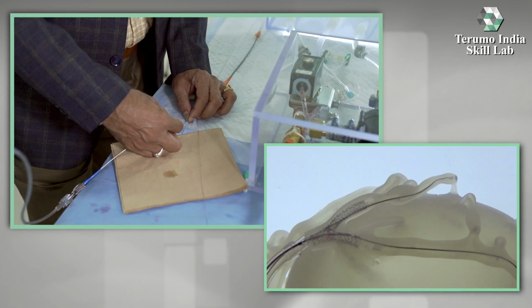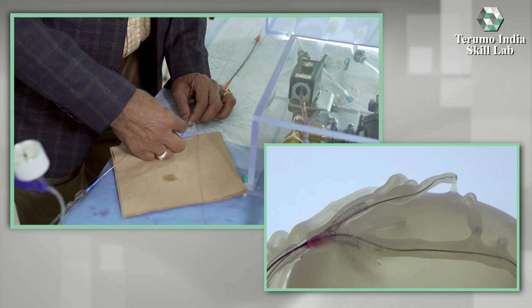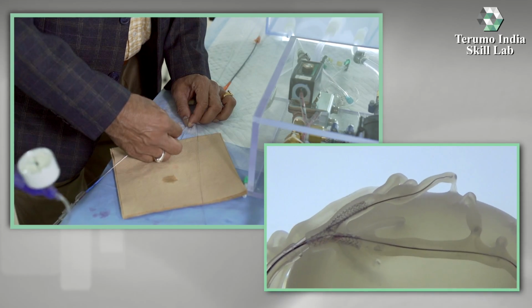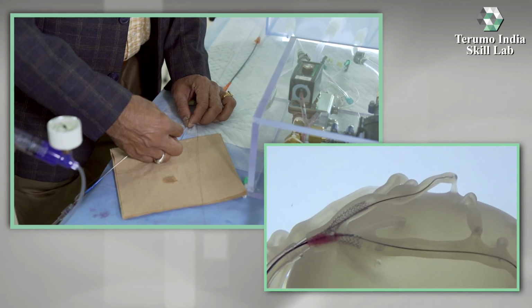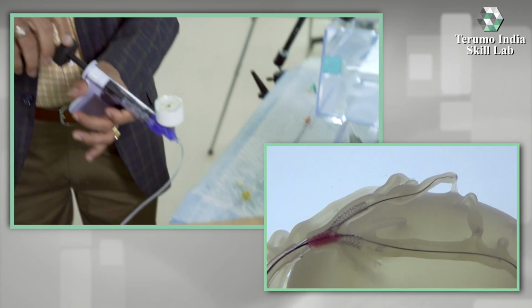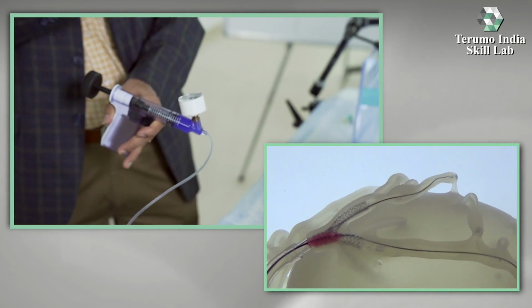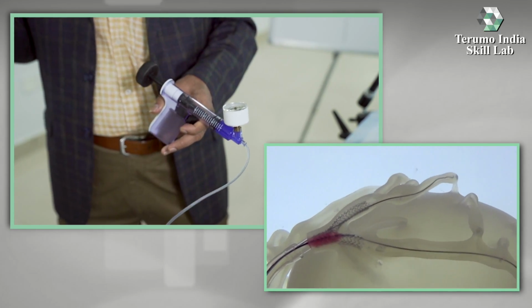No, deflate. No, good. Go. Yes. So this is a perfect deployment with the marker at the carina.